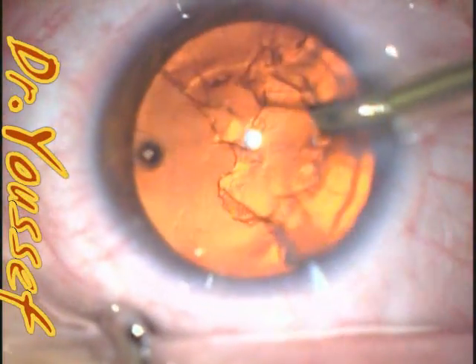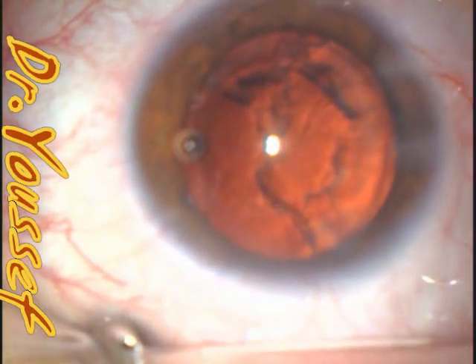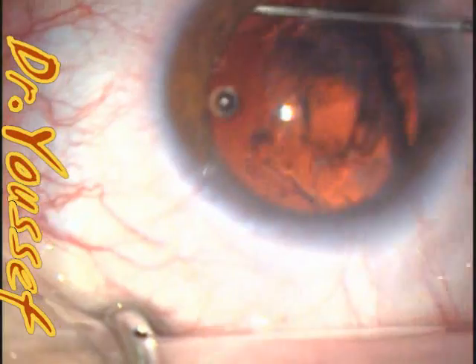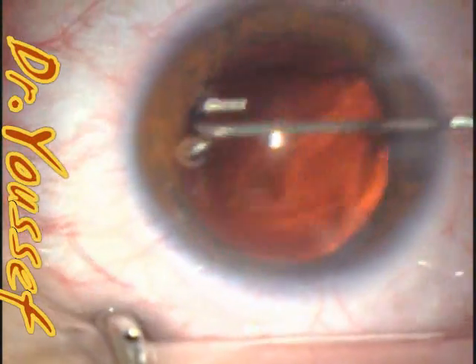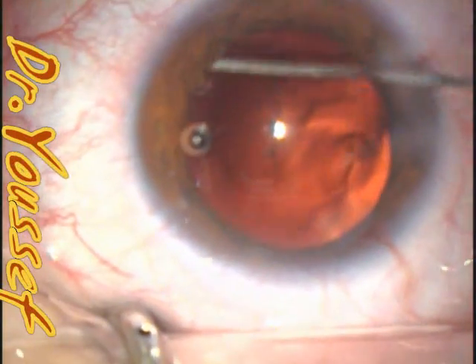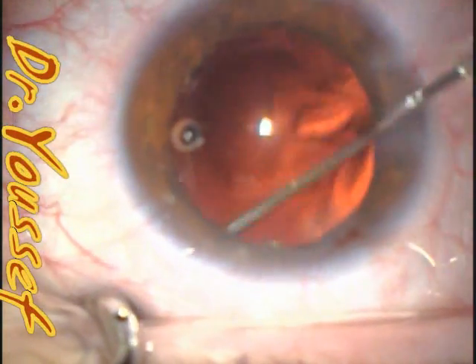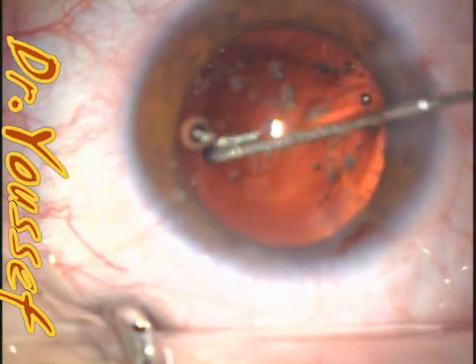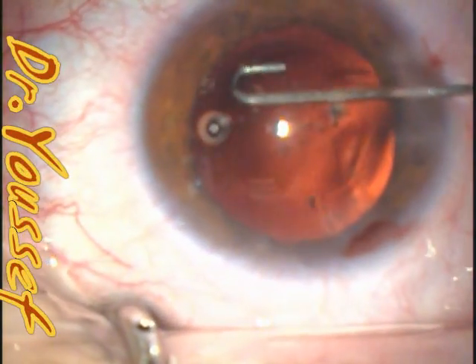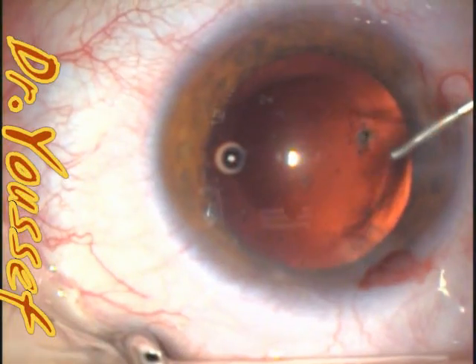This is the epinucleus. When you find epinucleus stuck underneath the incision, don't try to get it out with the phaco handpiece because you'll end up with a complication. Use the j-cannula — it's much safer. You can see it dragging the cortical material away from the subincisional area, safely and efficiently cleaning the capsule. The j-cannula is very safe for cortical cleanup, but you have to know what you're doing; otherwise complications arise if you're unsure about the tip location.